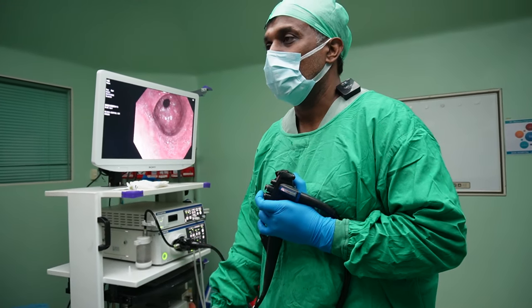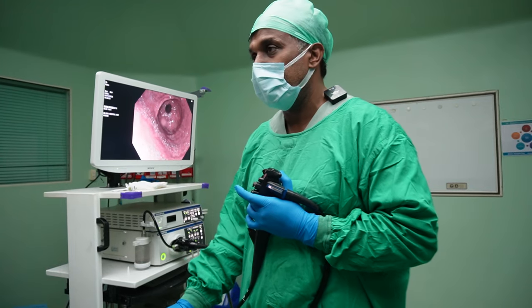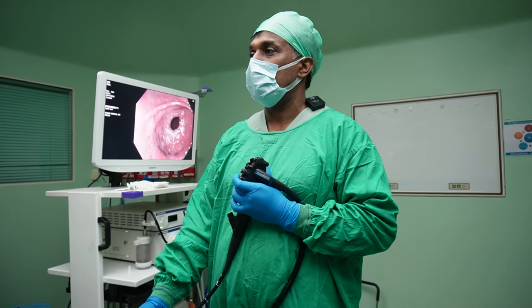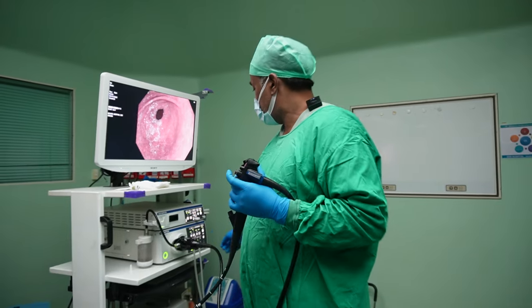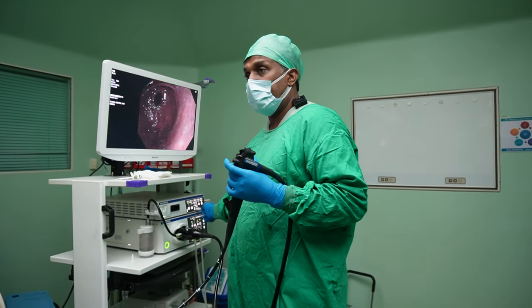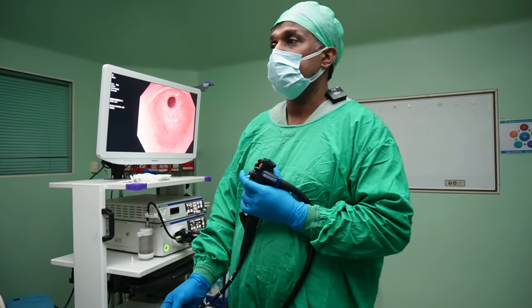Advanced endoscopy procedure. If you look at this, you will see the mucosal pattern of the stomach. You have the mild antral gastritis.